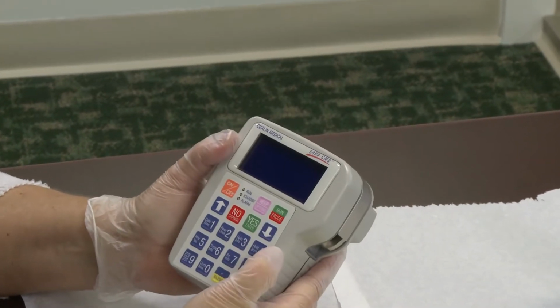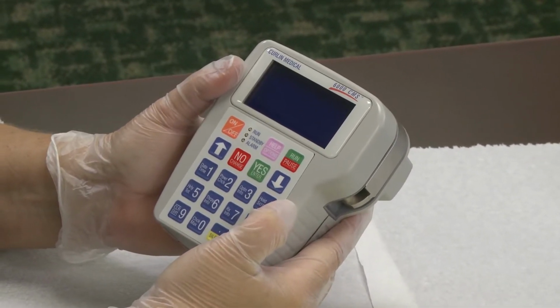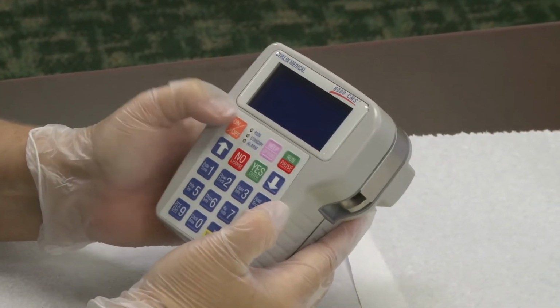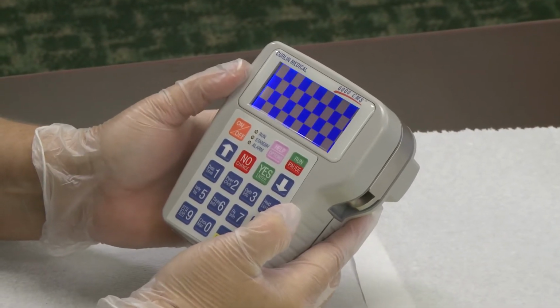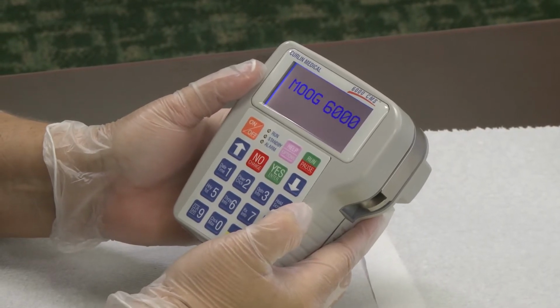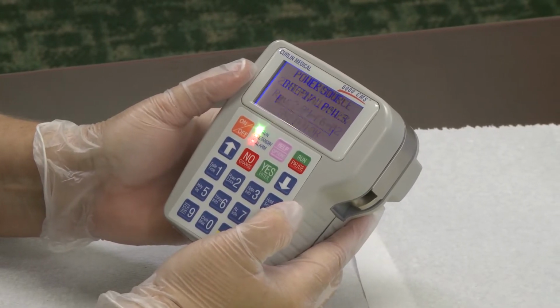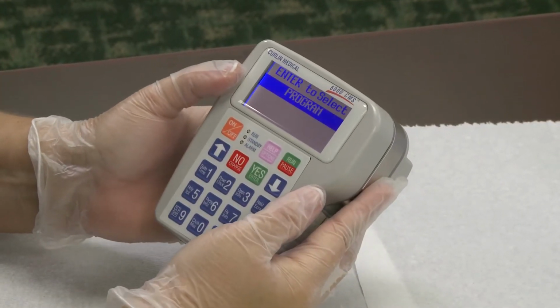The pump always comes programmed from your pharmacy, ready for you to use. I'm going to turn the pump on now, and we're going to look at how it's programmed from the pharmacy. This is the on-off button. I'm going to press. You hear the beeping. The pump does a self-check. Internal power is full. That's your power source from your batteries.